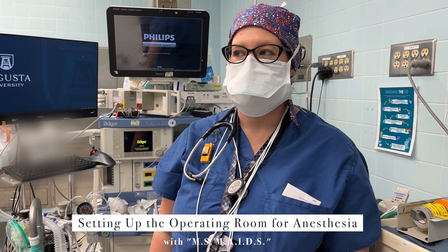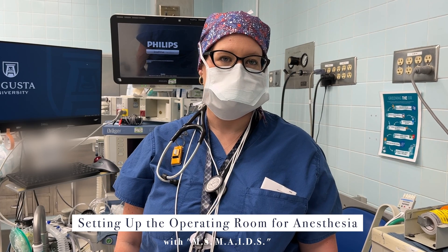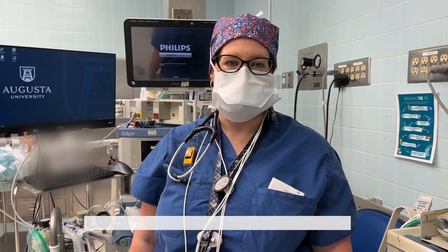Hi guys, I'm Sarah Wade. I'm a CA1 anesthesia resident at Medical College of Georgia in Augusta, and I am going to be walking through the MSMAIDS acronym for how to set up your anesthesia workspace at the start of the day before cases.